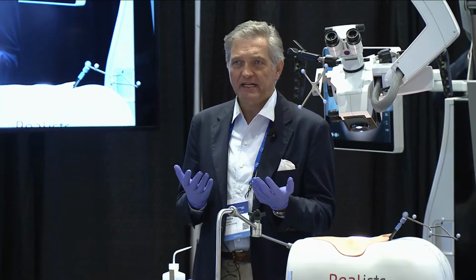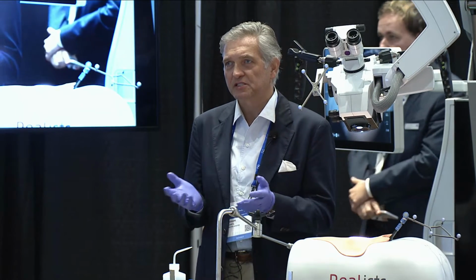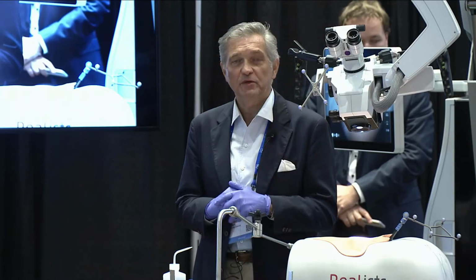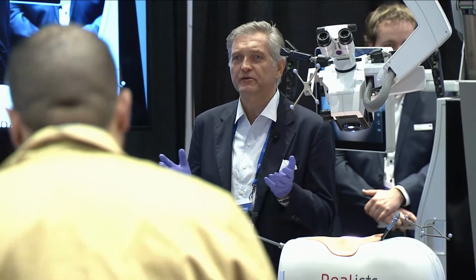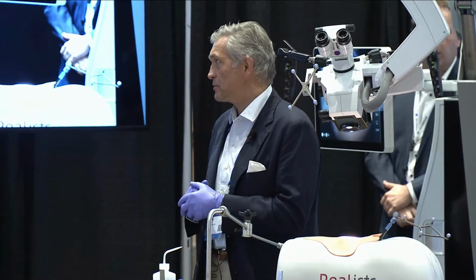So I like using navigation. Now we looked at our navigation numbers in our institution at New York Presbyterian, RealSpine, and Cornell in New York, and we navigate about 70–80% of our spine procedures, certainly the instrumented procedures. So we're very, very comfortable with navigation. We have a number of navigation systems available.